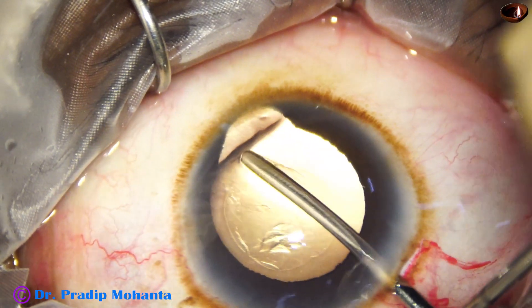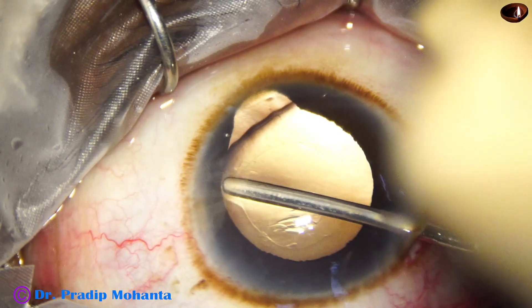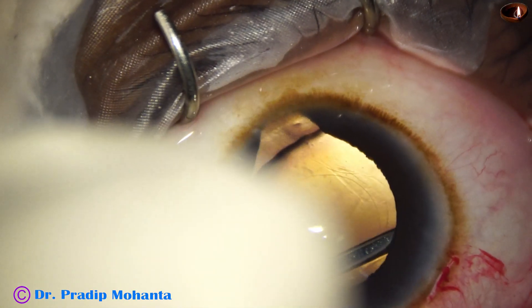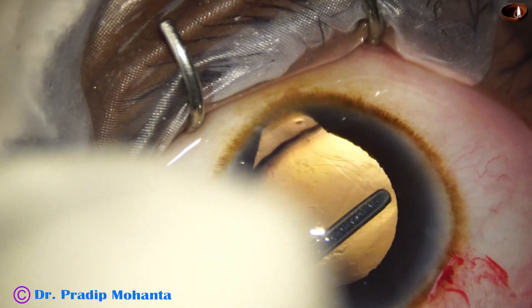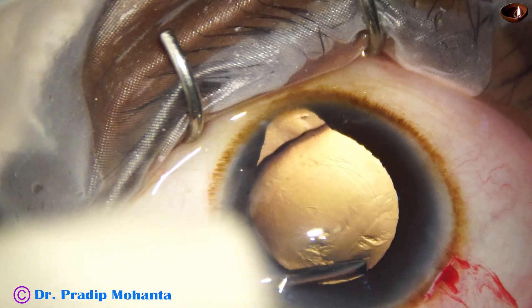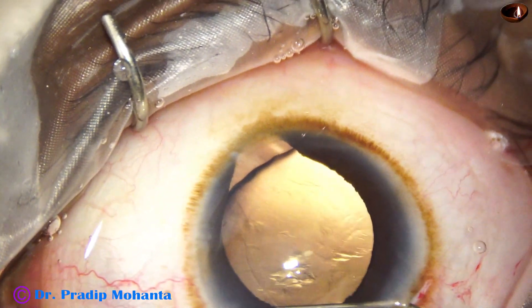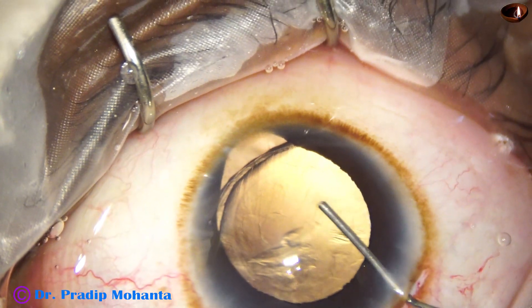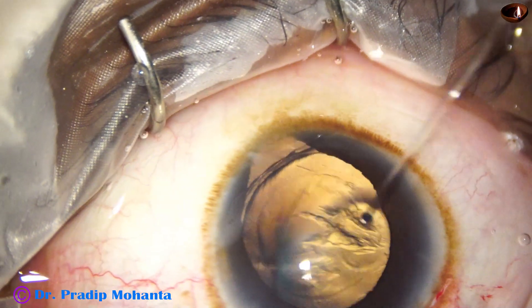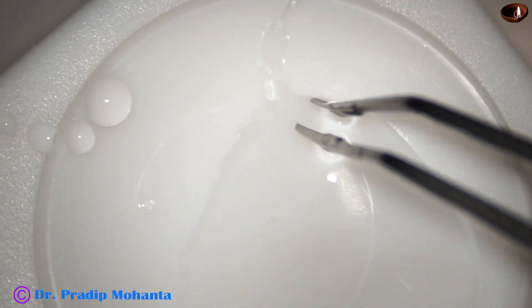This is an iris spatula. I am trying to separate the capsule from the cortex without doing hydro, but we can go only up to the equator with this. I was not sure whether I was above the capsule or under the capsule. And now I do hydrodissection, and I get a very good fluid wave.